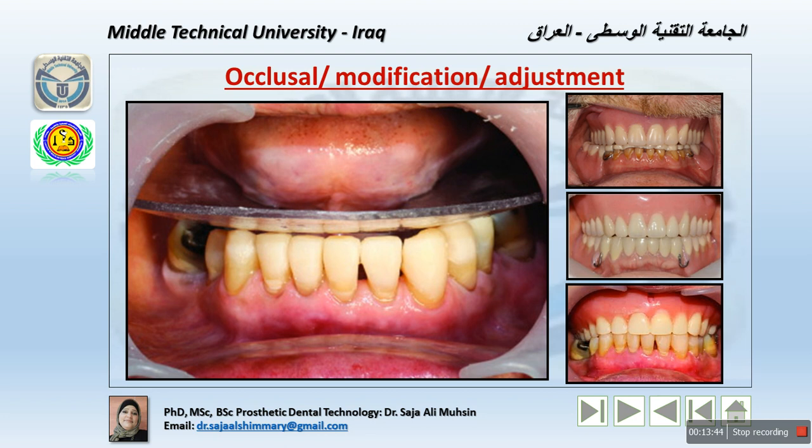Now, the reduced areas on the stone teeth are marked on the cast by pencil, and the occlusal adjustments are then carried out on the natural teeth in the mouth using the pencil-marked diagnostic cast as a guide. All these steps should be modified in terms of construction of a single complete denture which is acceptable in terms of occlusal plane and harmonizing perfectly.